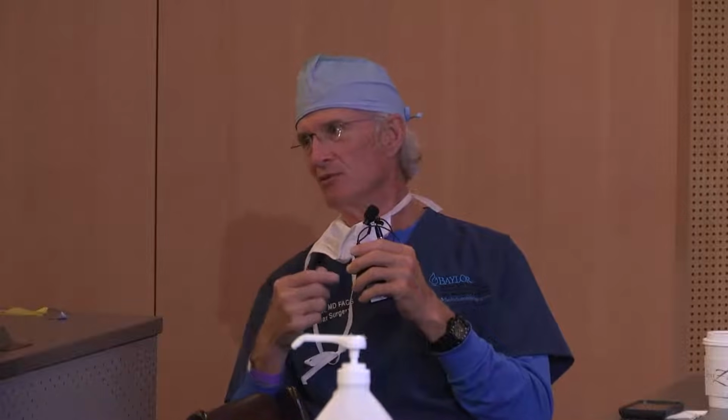So typically with a common iliac occlusion, though, I'll try from below, take a wire, and come up. Usually I embed the wire in the thrombus, because the last thing that happens in an iliac stenosis is thrombosis. It wasn't calcification. The last bit is thrombus. And that's what you're using the wire and catheter to negotiate through, that soft stuff. And the way I was taught to do it was to embed the wire with the catheter right at the tip and literally spin that wire at 60 hertz.